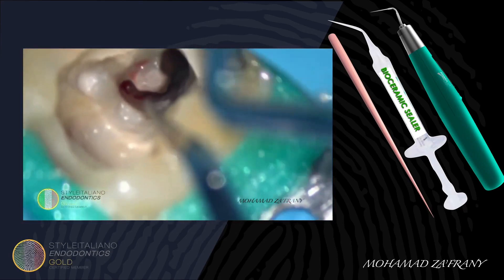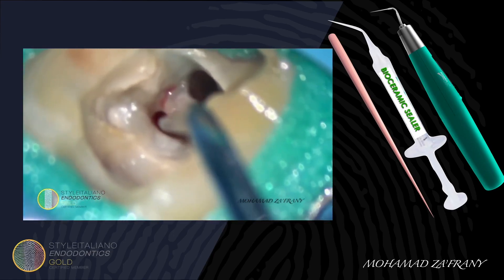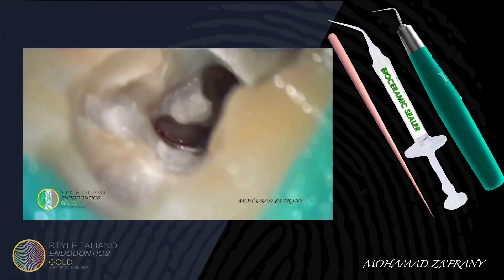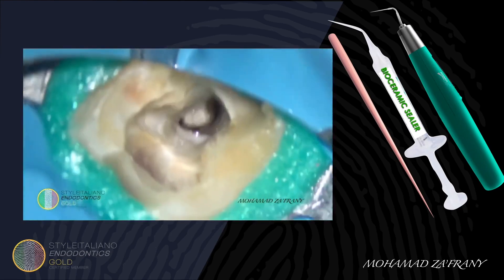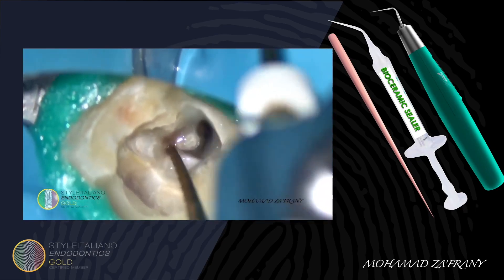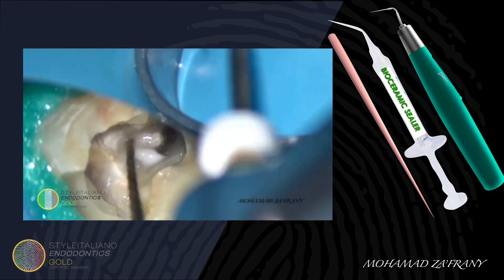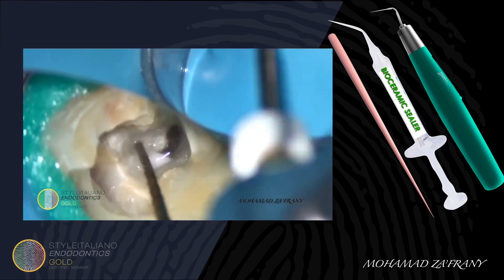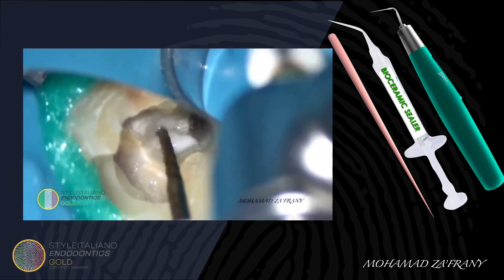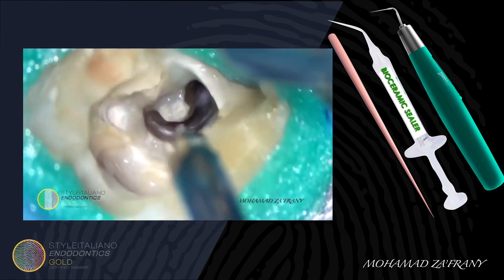You can see that the mesial canal was already vital. Irrigating the isthmus. Glide path preparation to the mesial canal using file size 17-04, with a stroking motion and passive insertion of the file into the canal. Cleaning the isthmus using ultrasonics.